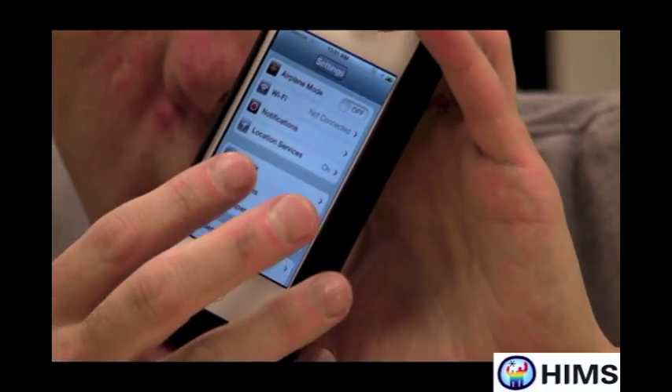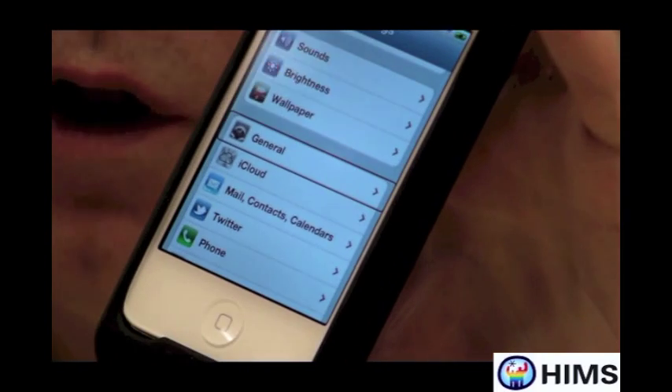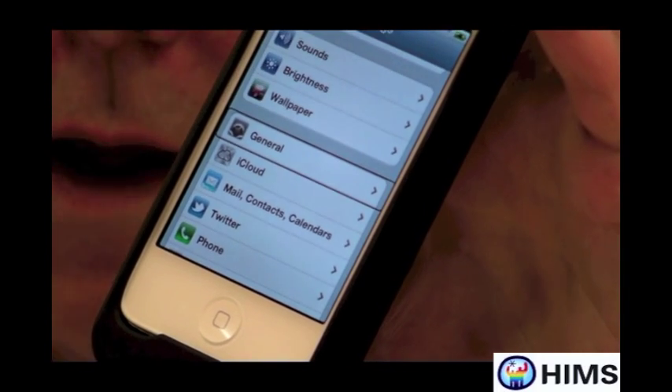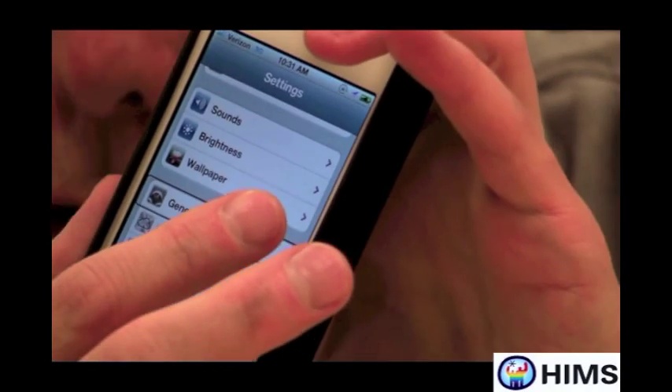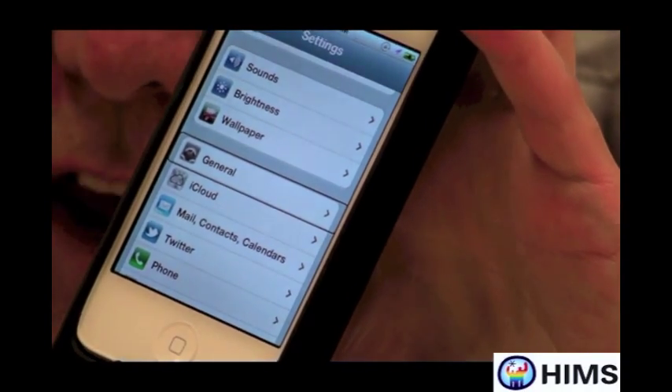The first thing I want to do in Settings is find General. You'll notice that I was literally flicking on the screen until I found General, or I could have found General on my iPhone screen and double tapped on it. I'm going to double tap on General.